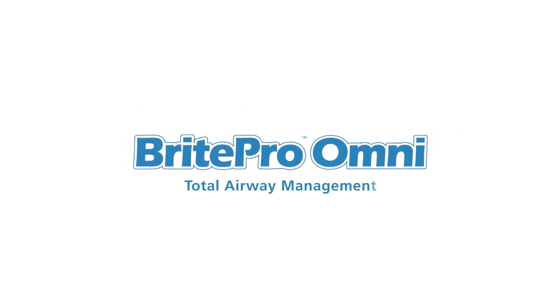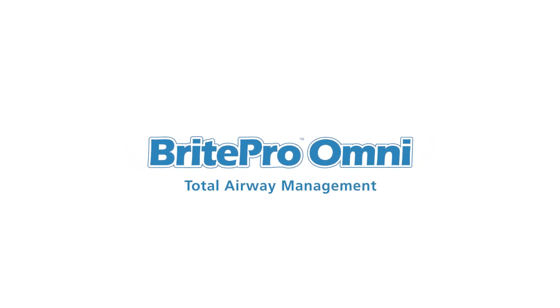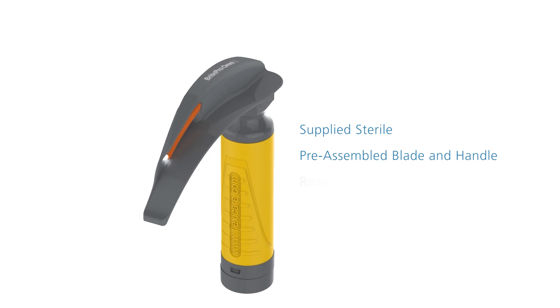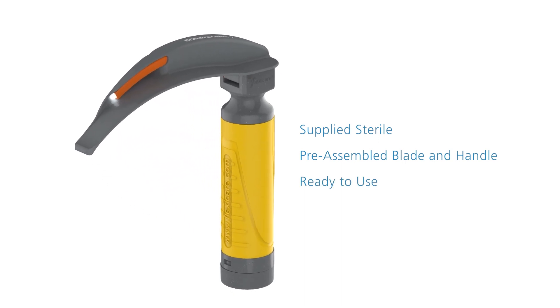BritePro Omni total airway management. BritePro Omni is supplied sterile as a pre-assembled blade and handle, and is ready to use straight out of the pack.